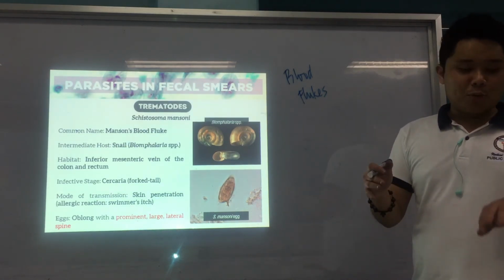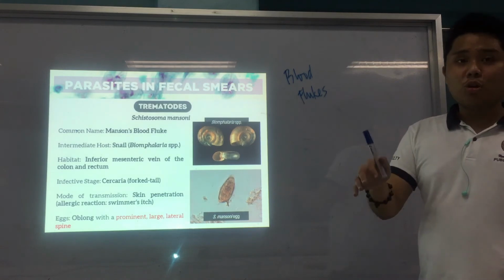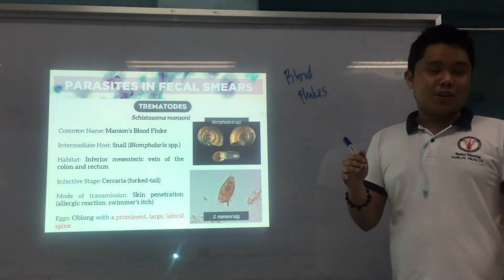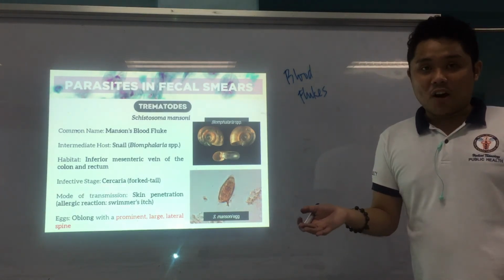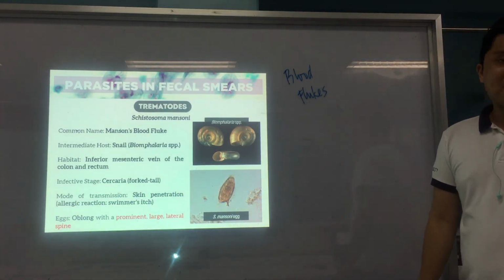Now, your Schistosoma haematobium may also be retrieved from your stool, but that's rare. Most of the time, Schistosoma haematobium is retrieved from your urine. Alright, that's Schistosoma mansoni.